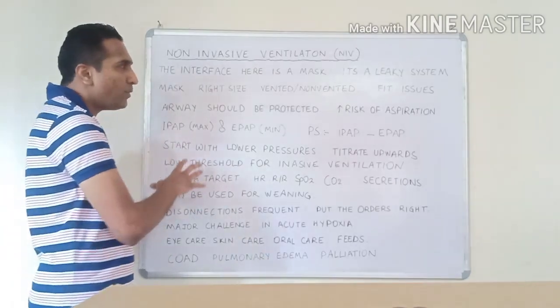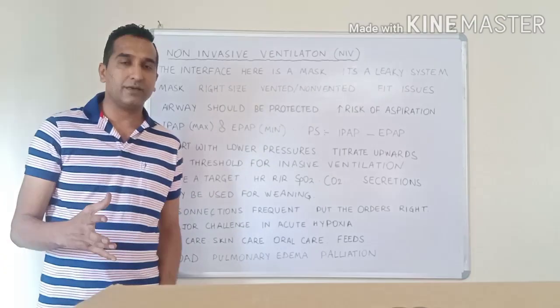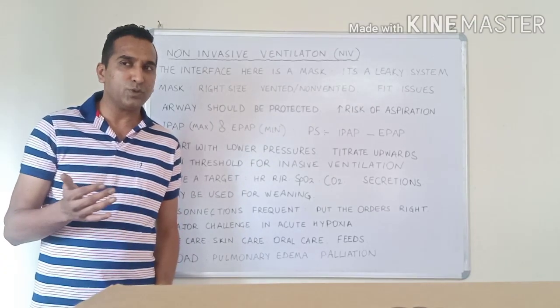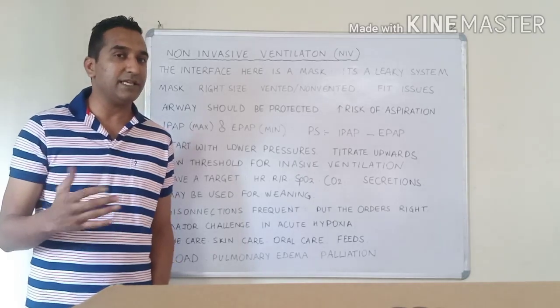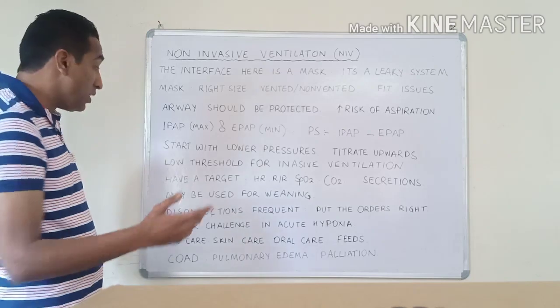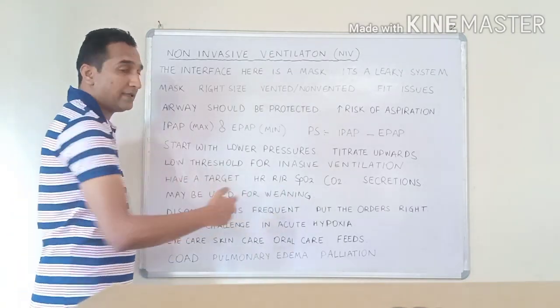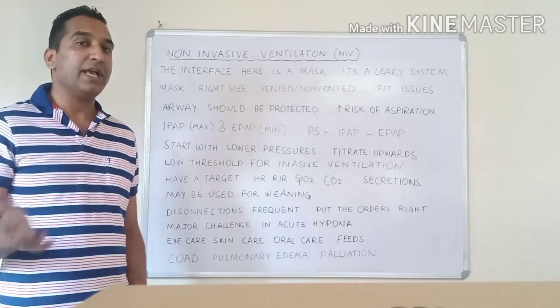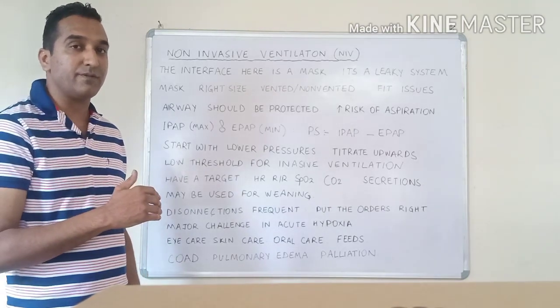It may be the only mode of ventilation that you require. It may be a ventilation that you take a chance upon in a patient who may or may not require invasive ventilation, you are not sure and you want to see improvements. And it may also be used for weaning. So your patient has been on an invasive ventilator, requires some kind of respiratory support, and you switch over from an invasive to non-invasive ventilator.